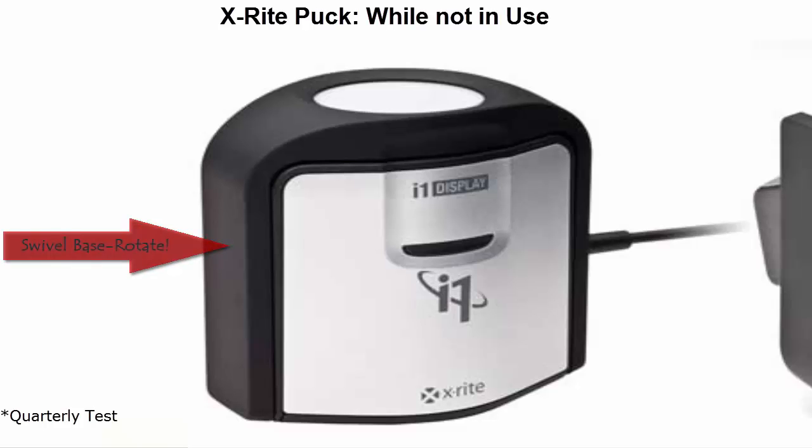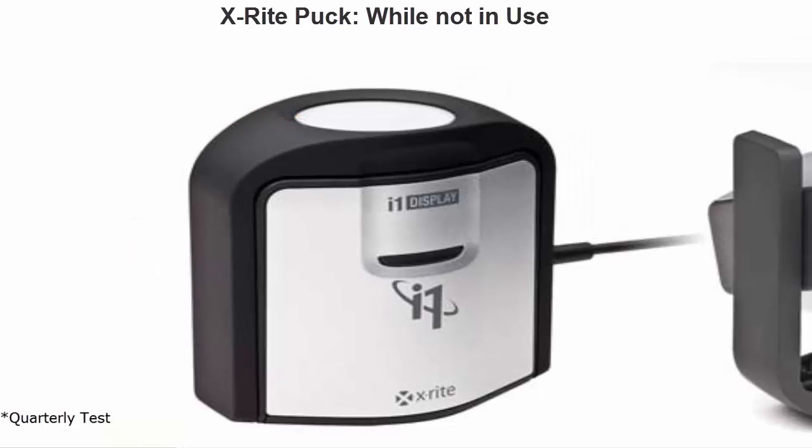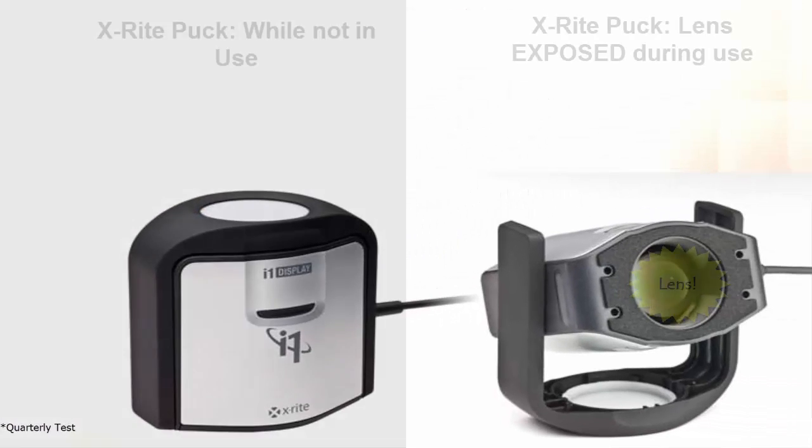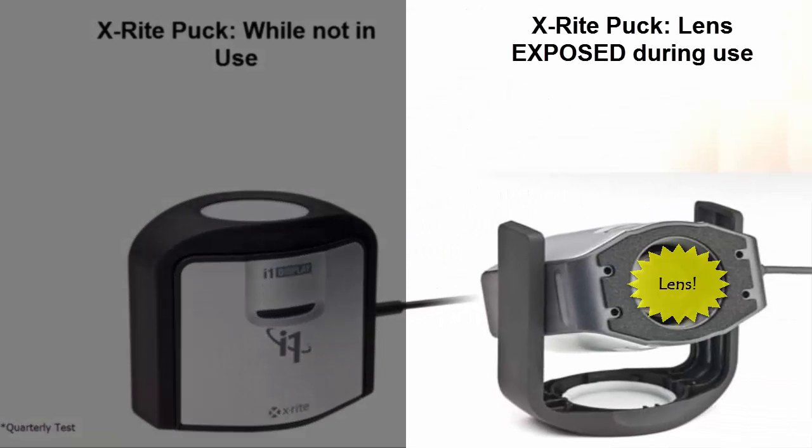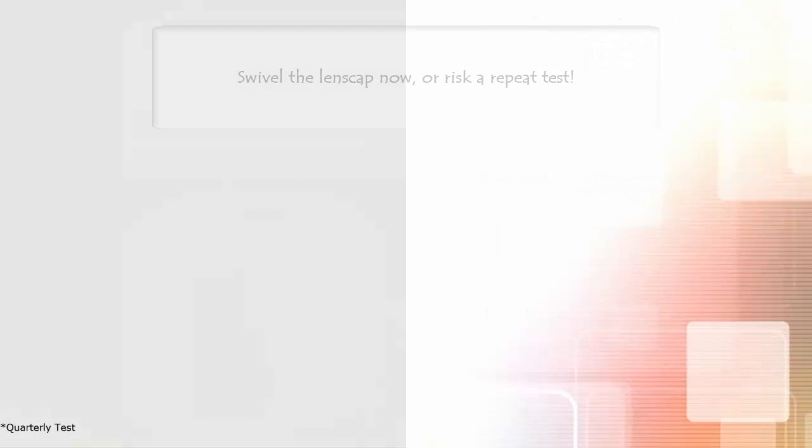Please ensure that if you are using the X-Rite puck, that the lens cap swivel is rotated to expose the lens. If the test is run with the lens cap on, the ending result will be a failure.